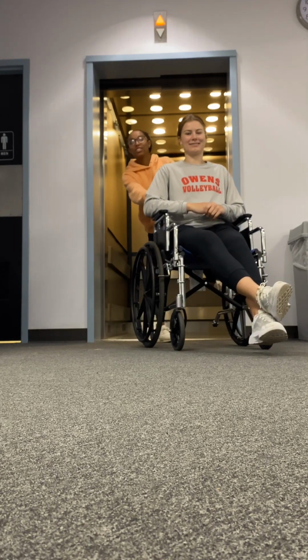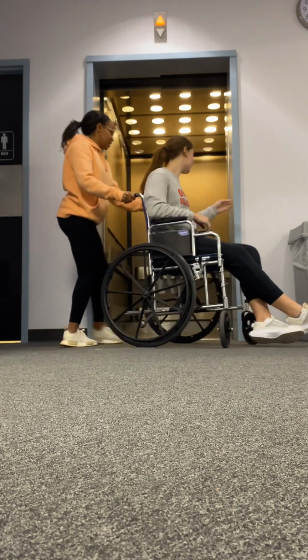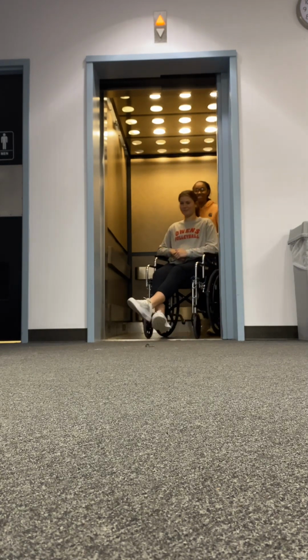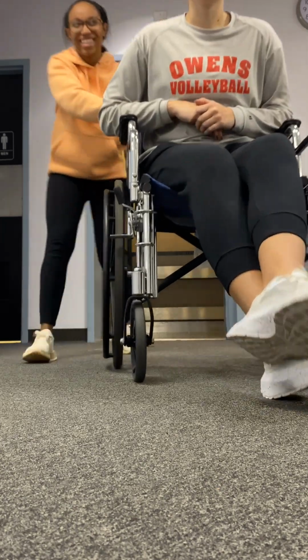And now we're gonna do going in forward and coming out forward. Going in forward. Go. Now we're going to do doorways, and the first one will be our doorway with the button.